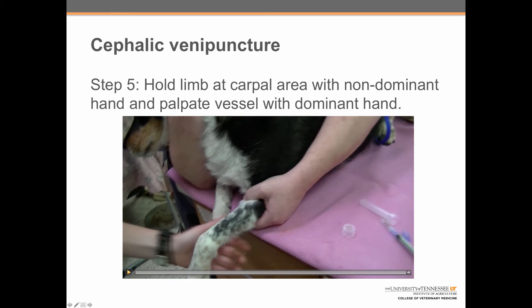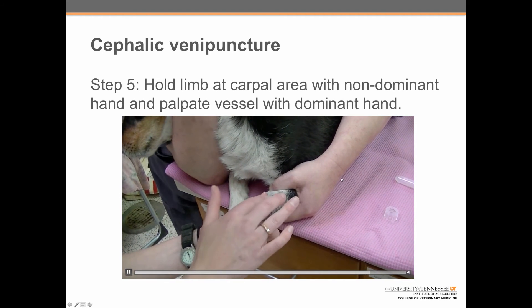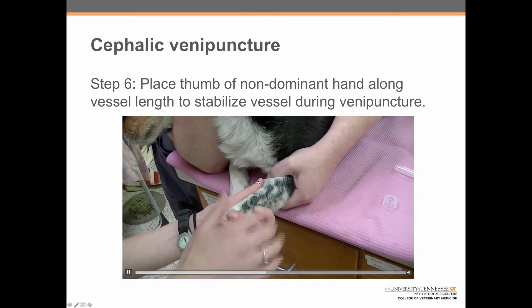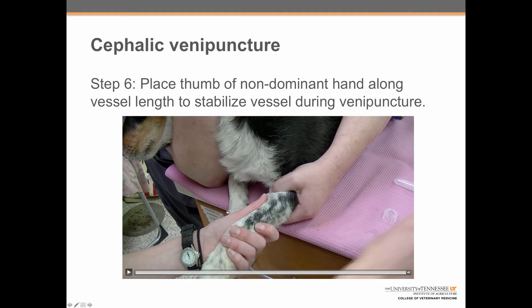Step five: now she holds the limb at the carpal area or wrist with her non-dominant hand and palpates the vessel with her dominant hand to confirm vessel feel and the pressure being applied. Step six: it is really important to place the thumb of the non-dominant hand along the vessel length to stabilize the vessel during venipuncture. We can see her extending her thumb all the way along the forearm to hold that vessel in place. Because of the anatomy of the dog, this vessel can wiggle side to side, so this step is critical.